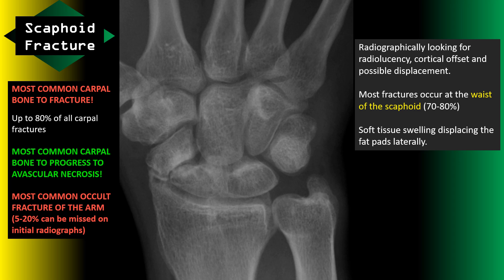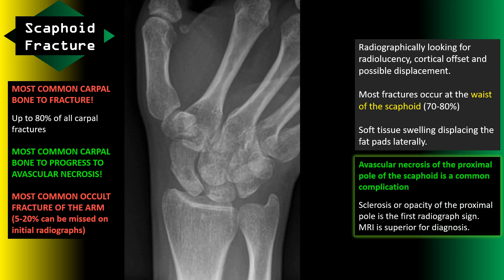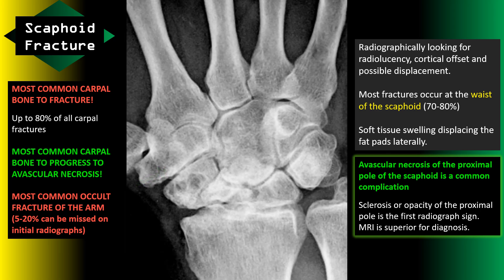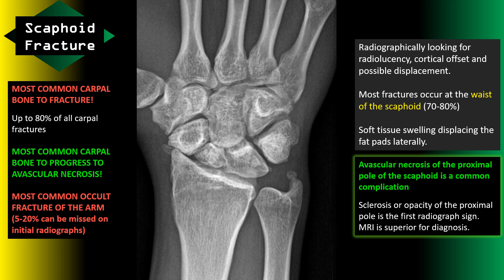Scaphoid fractures are the most common radiographically occult fracture of the arm, and up to 5 to 20 percent can be missed on initial radiographs. The scaphoid is the most common carpal bone to progress to avascular necrosis — specifically of the proximal pole. On x-ray, look for sclerosis or opacity of that bone; MRI is the gold standard for evaluating avascular necrosis. Here is a good example of a non-union scaphoid fracture with secondary degenerative changes.